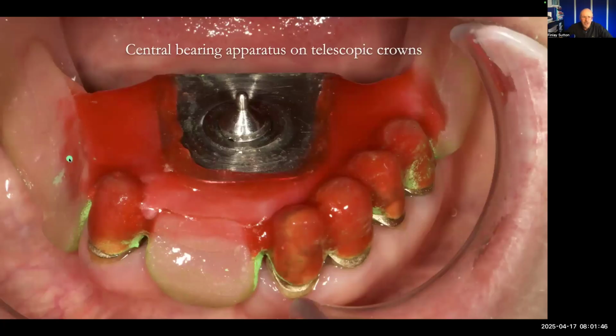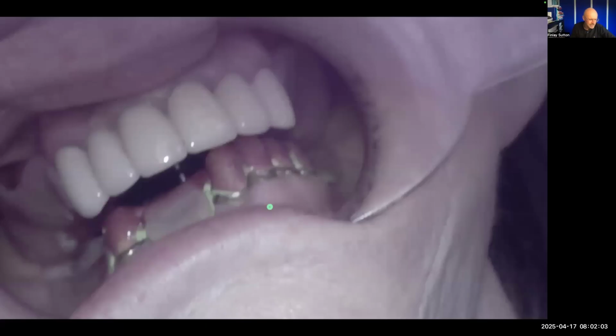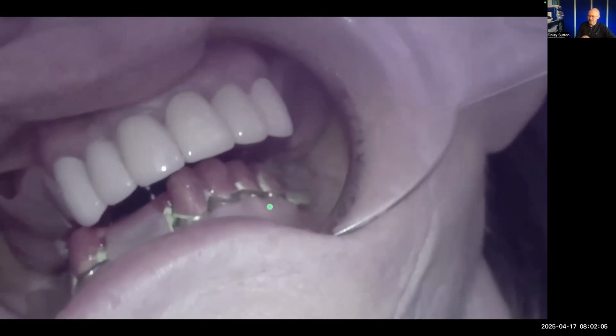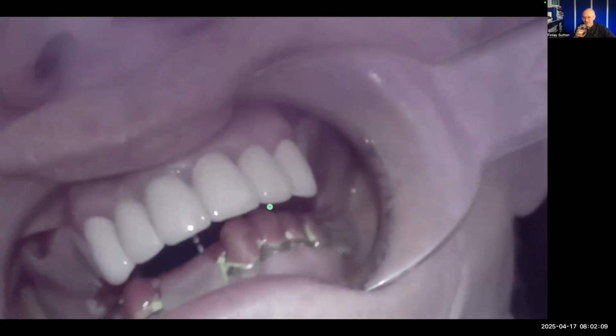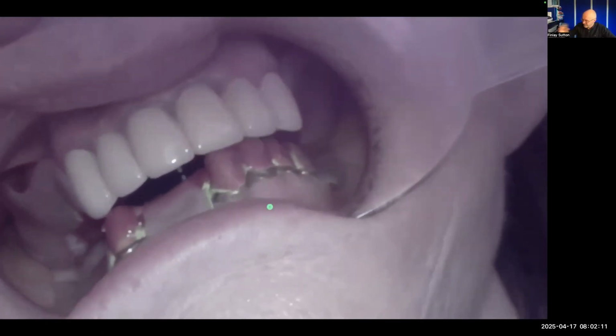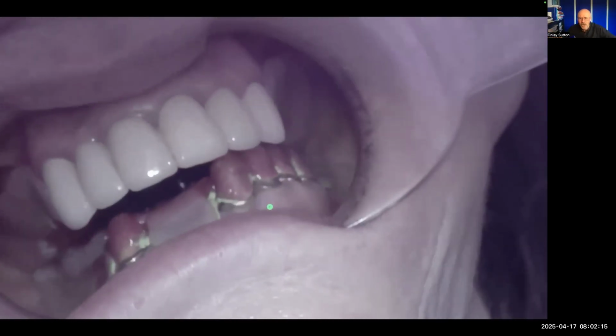So this is the lower with that central bearing pin, the stylus, into the mouth. The upper goes in. You can see that's at the back there, at the top there. So we've got a stylus biting onto the plate. And then I asked Jackie to move around. So, and this is it in the mouth there. So I get her to move side to side, go forwards and backwards, move anywhere.